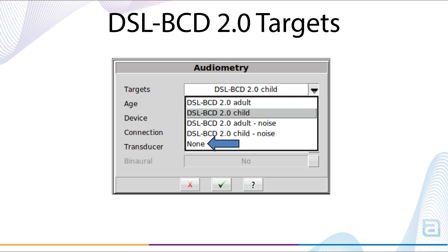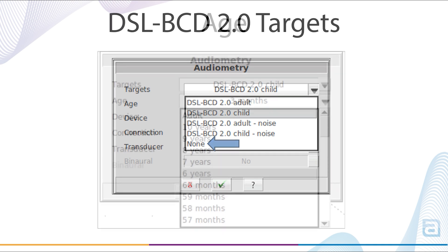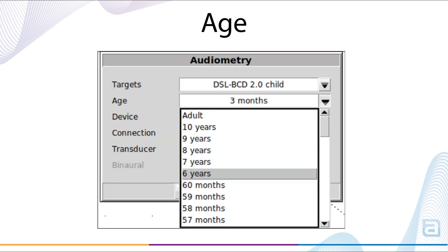Age sets the skin transmission loss correction based on the patient's age. Select age from 1–60 months, 6–10 years, and adult.